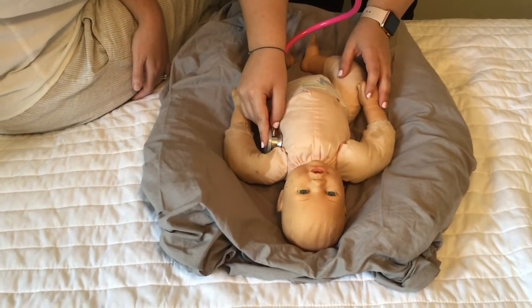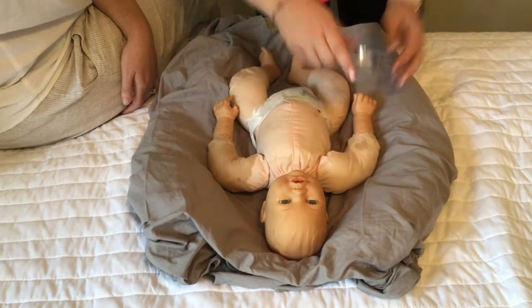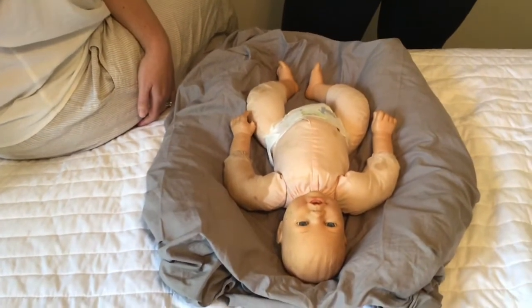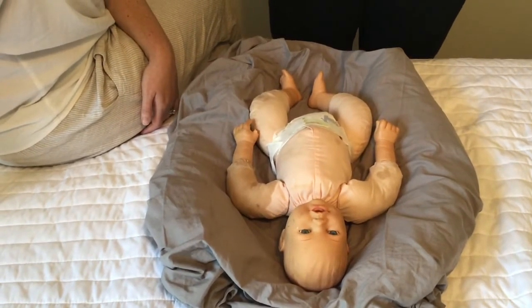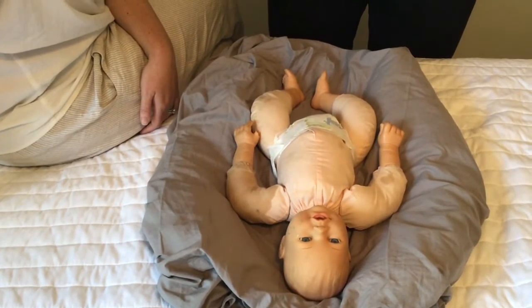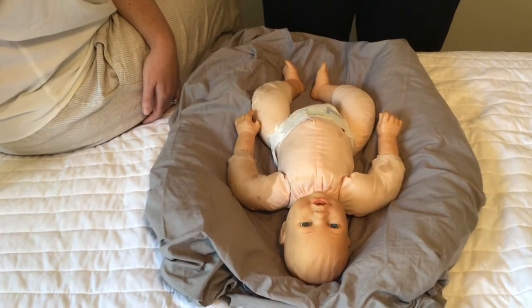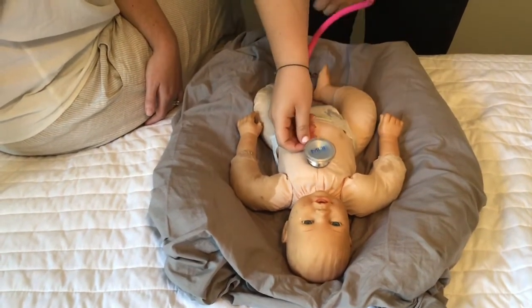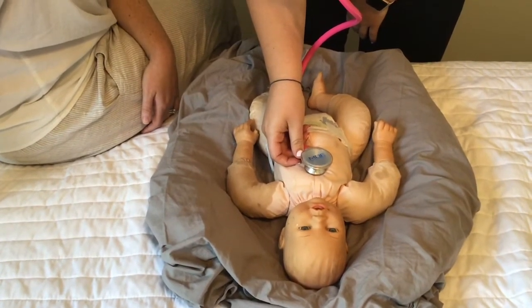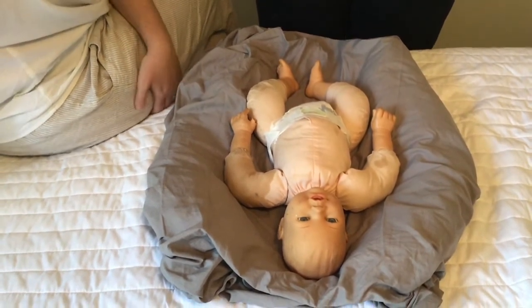Again, warming up the stethoscope. Do note some crackles, which is normal for this age, okay, and a vaginal birth. We're going to then check for her apical pulse again, and we're going to be assessing for a murmur, okay? Apical pulse is 148, no murmur detected.